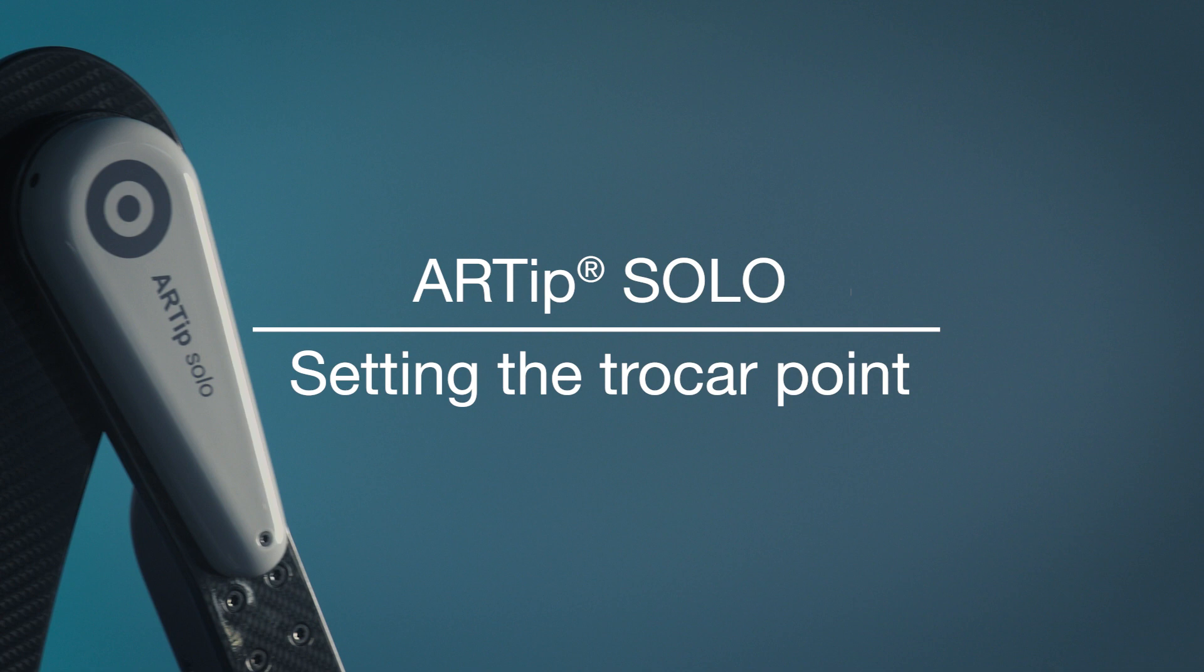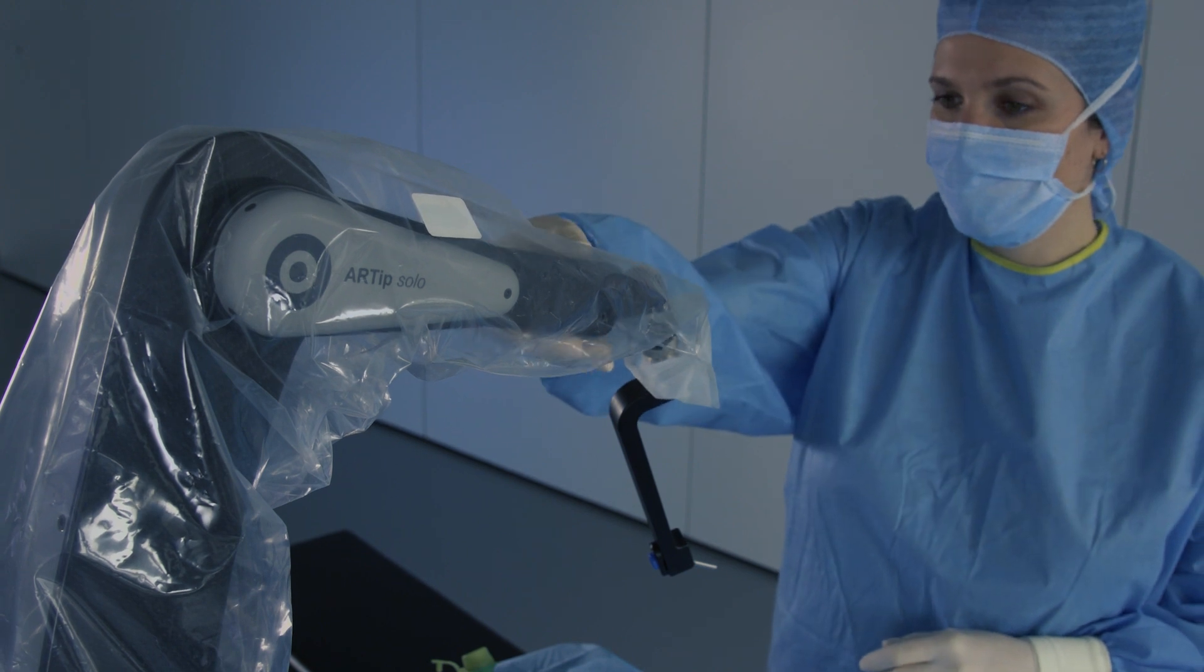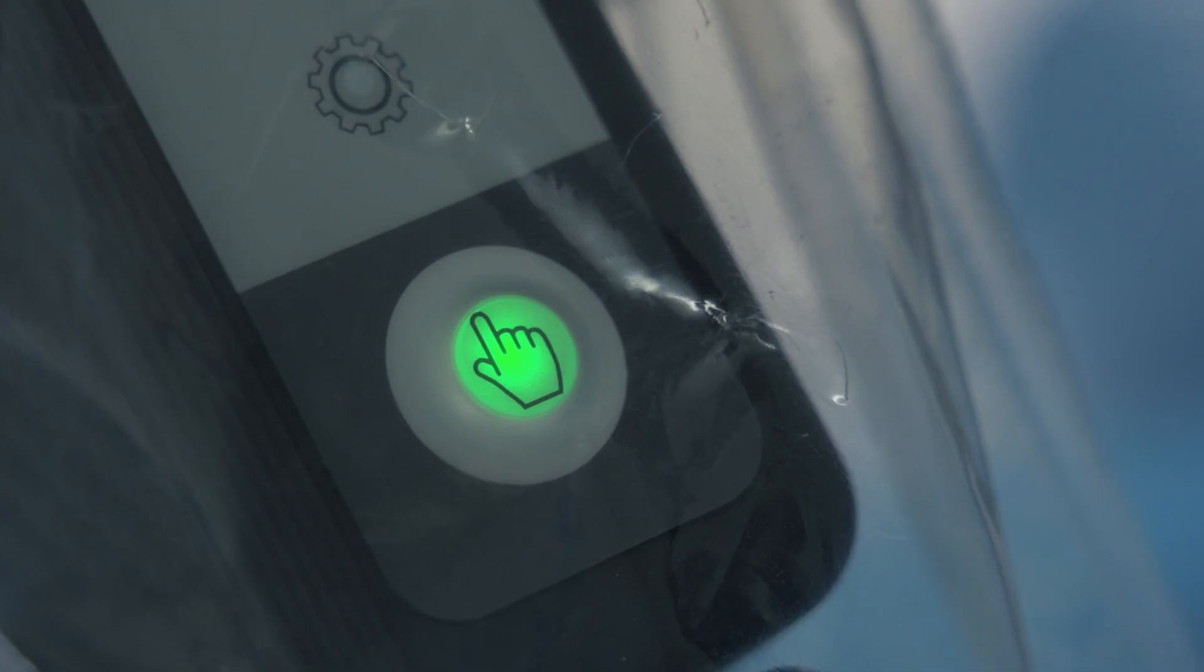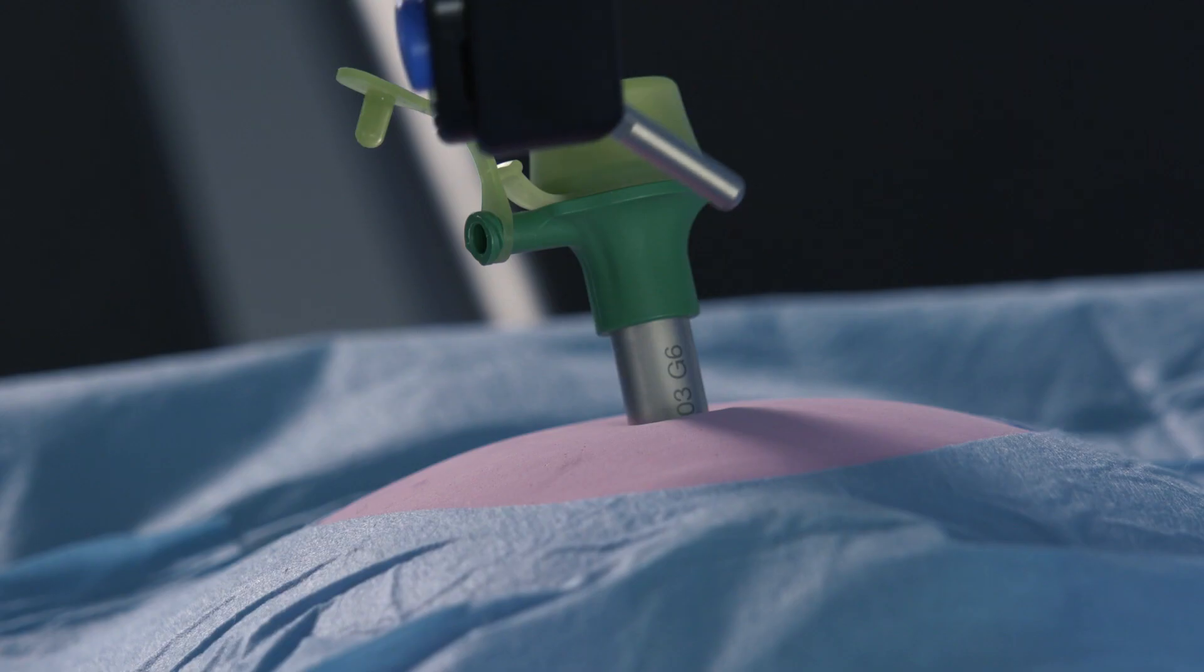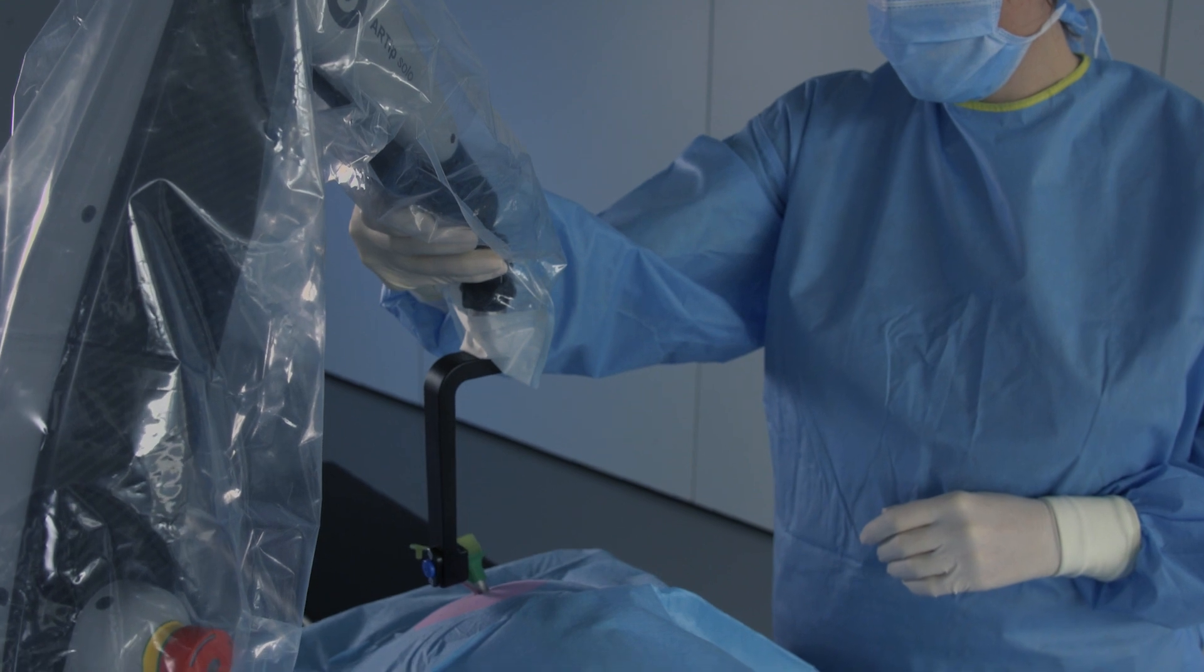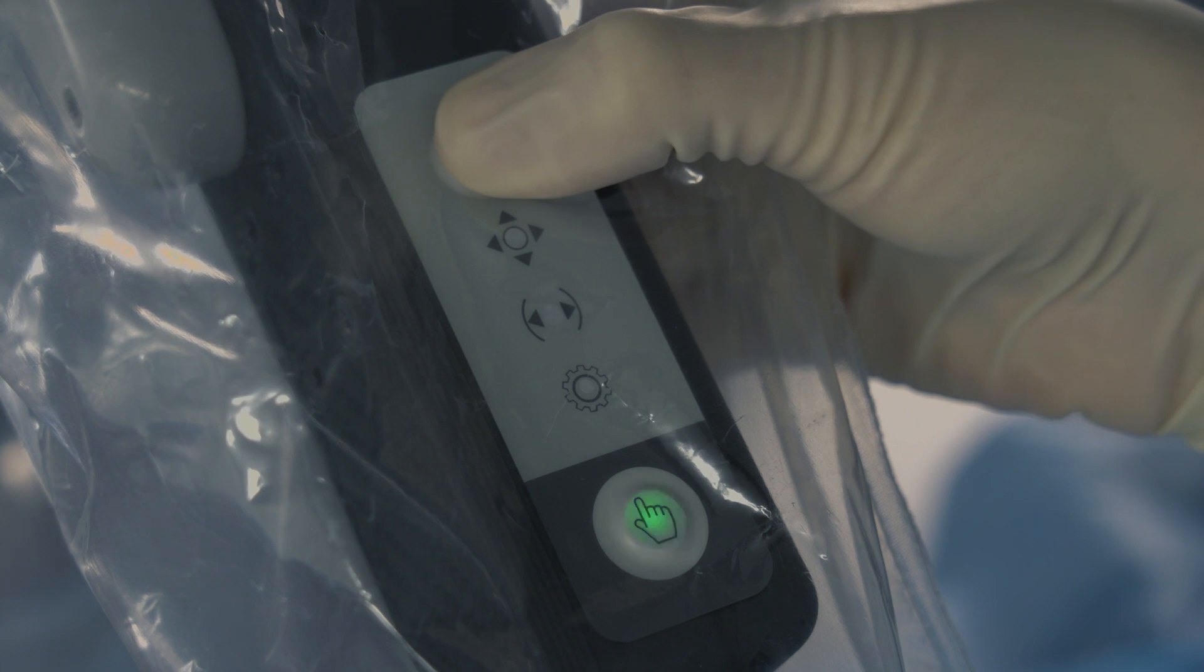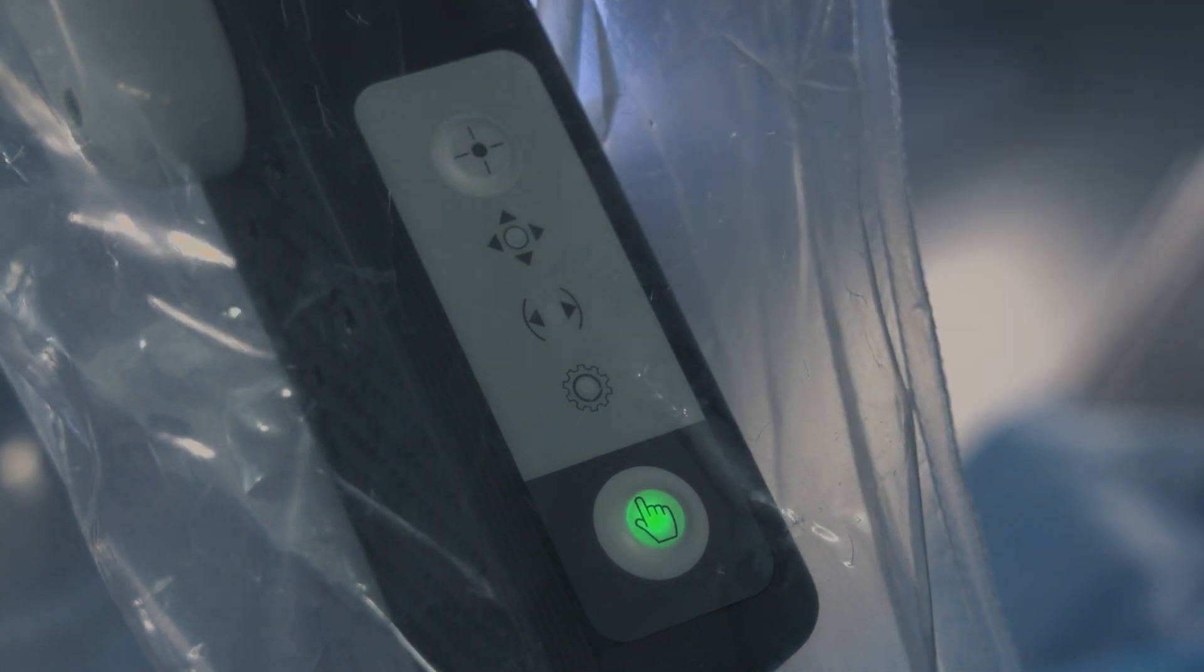If utilizing the joystick feature, the trocar point must be set to establish an access point between the patient and the R-Tip Solo. Move the R-Tip Solo by pressing the unlock button on the control panel, directing the tracer pin to the point where the trocar meets the patient. Once in position, press the top button for about two seconds until you see a blinking green. This means you have successfully set the trocar point.